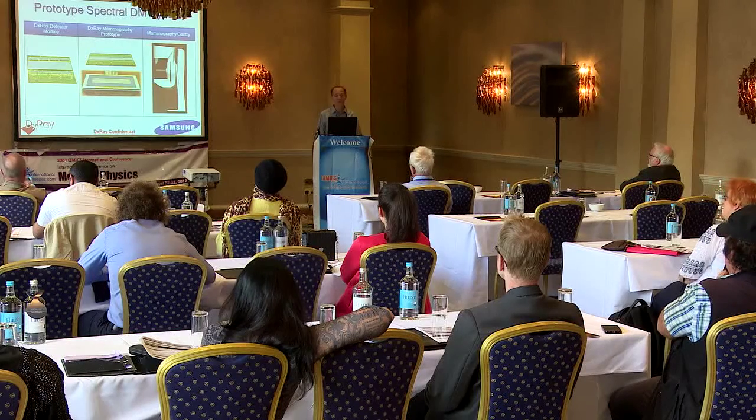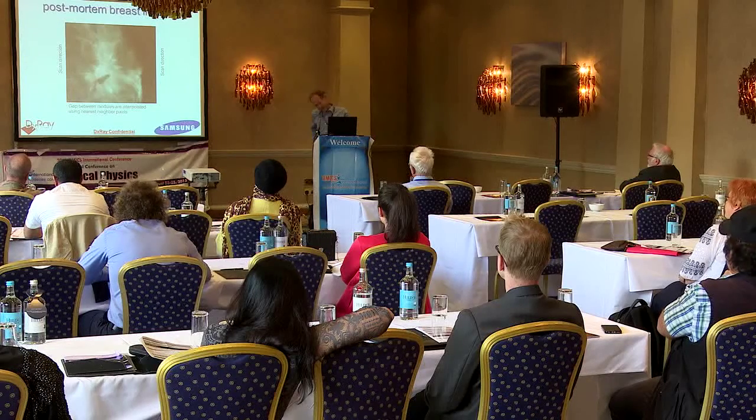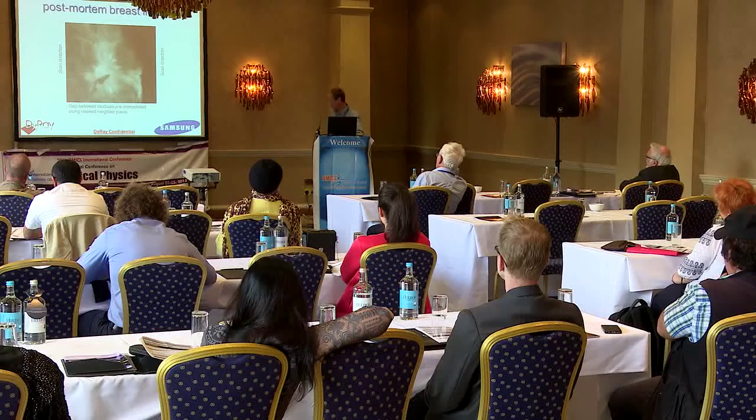I took this prototype and installed it into a system at Samsung and scanned a breast here to produce this. This is at about 6 times lower dose than for conventional mammography, which is at about 6 milligray. This was taken with less than a milligray of dose.